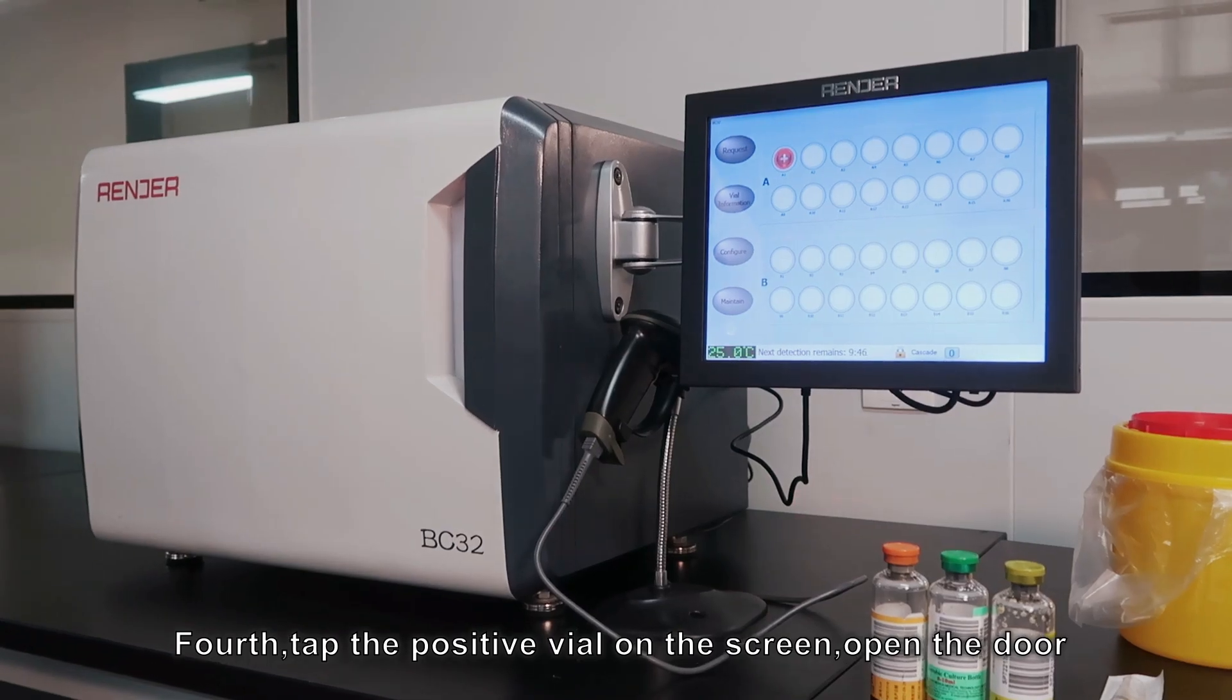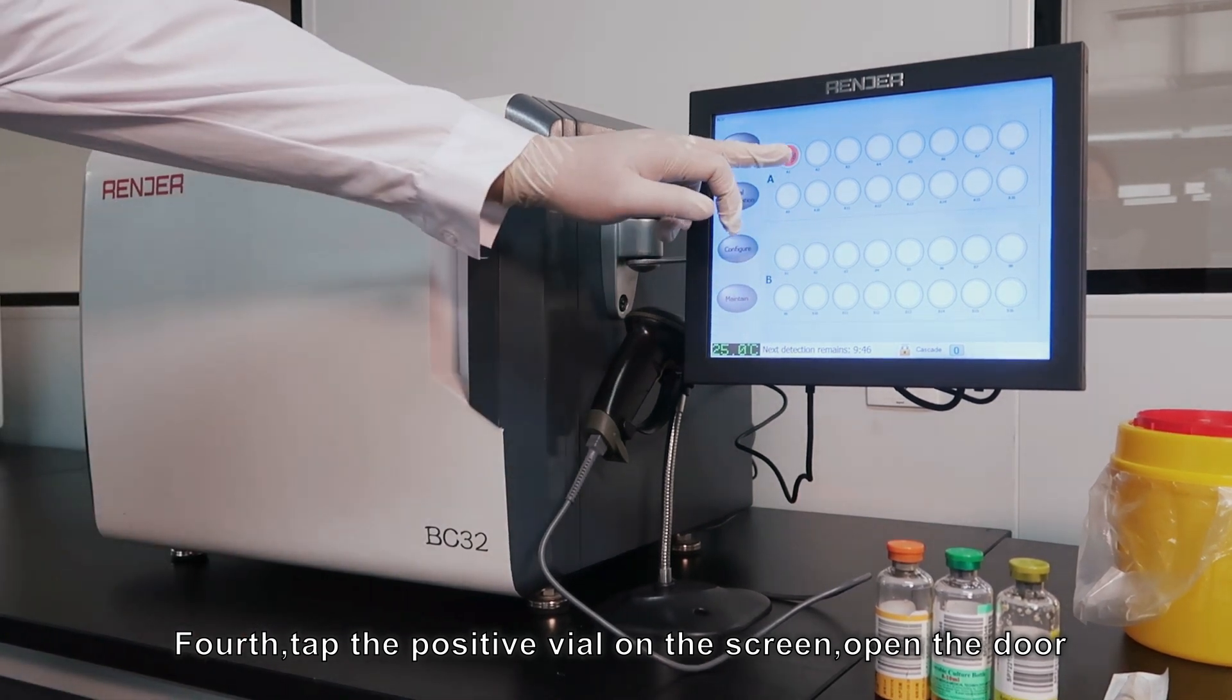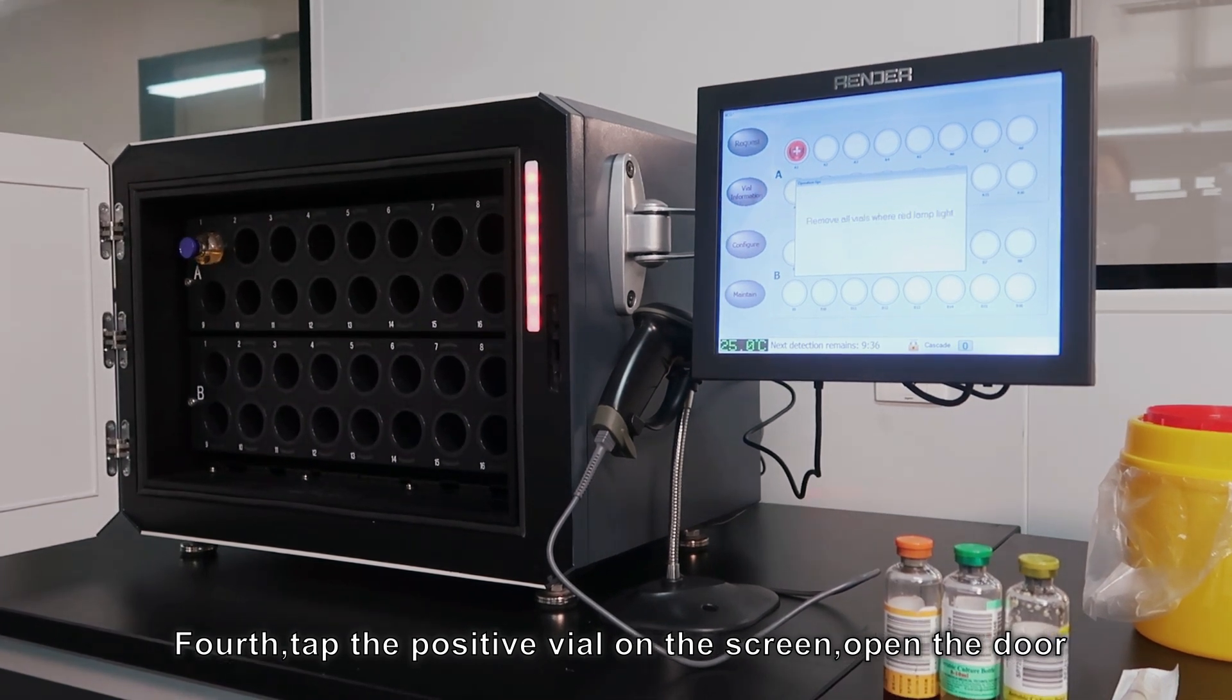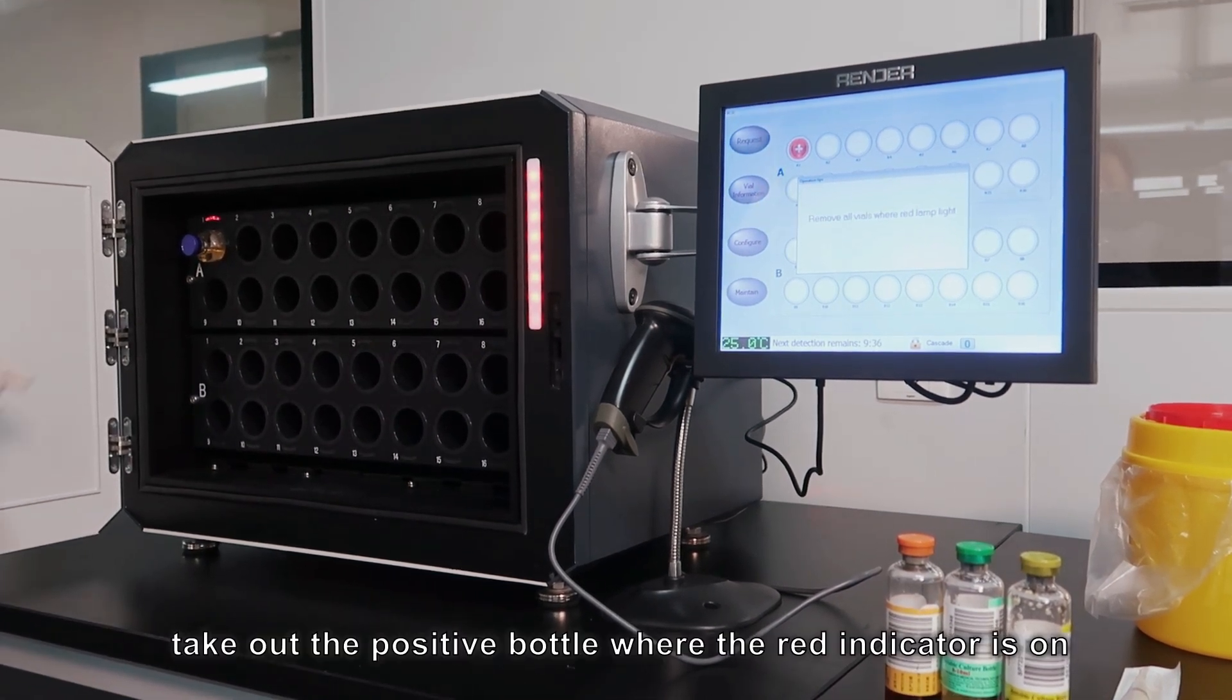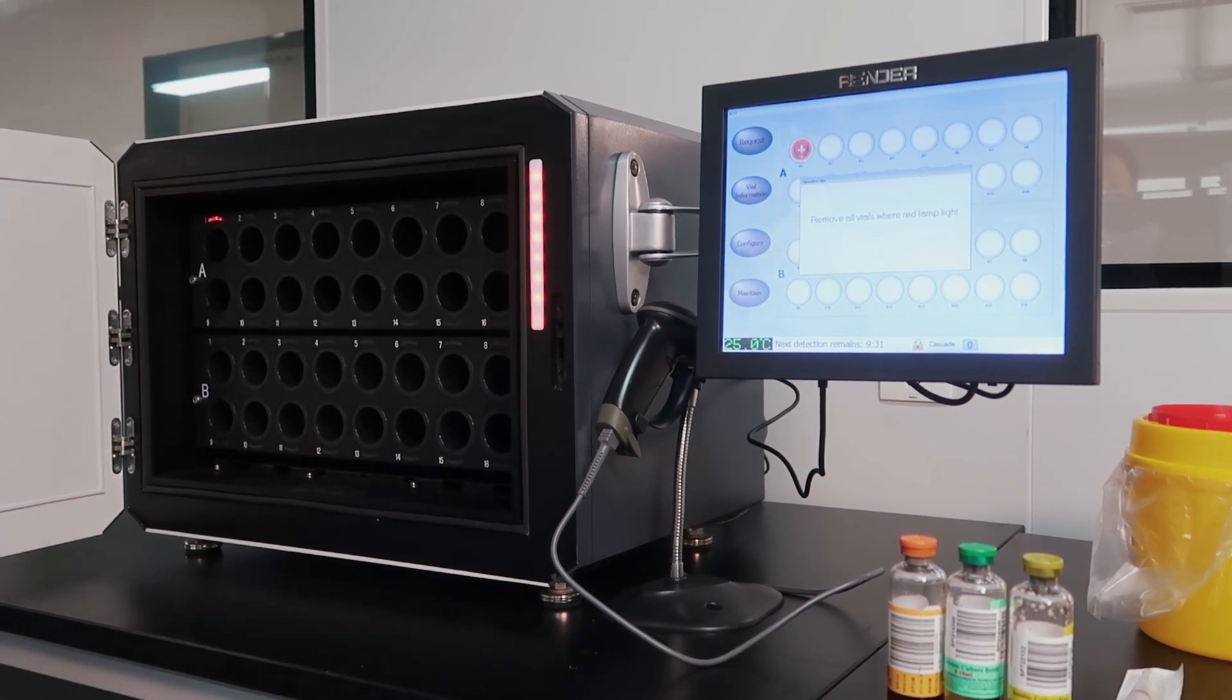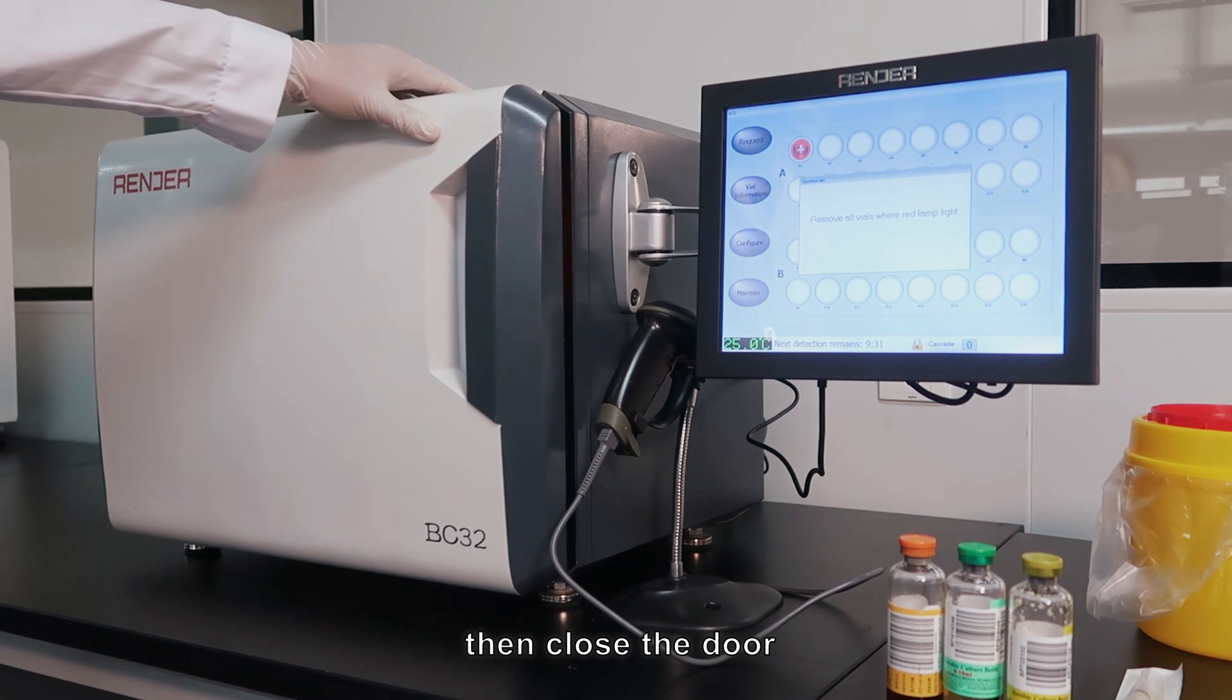Fourth, take out the positive bottle. Click the positive bottle indicator on the screen. Open the door. Take out the positive bottle where the red indicator is on. Then close the door.